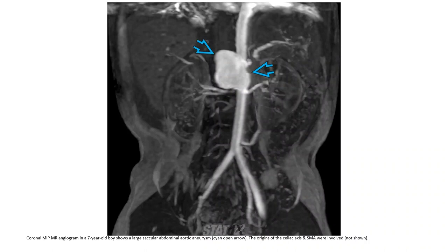MIP image in a seven-month-old boy shows a saccular abdominal aortic aneurysm. The origin of the celiac axis and SMA were involved.